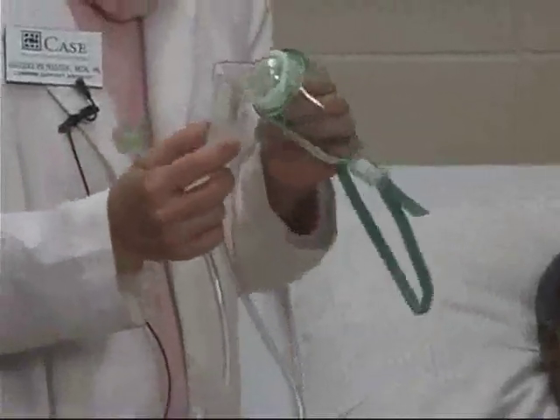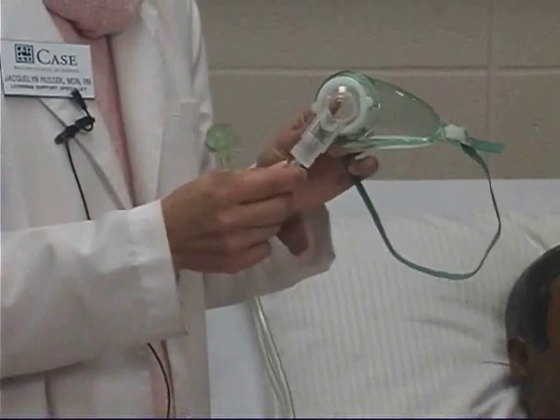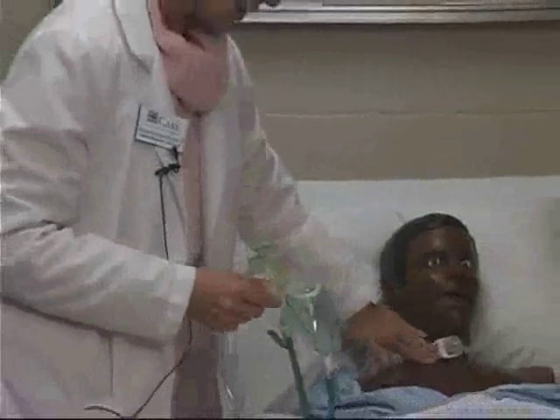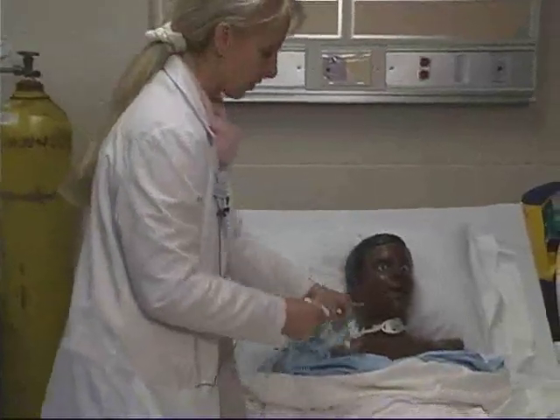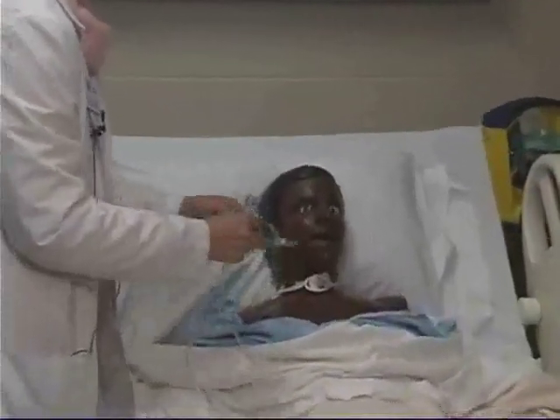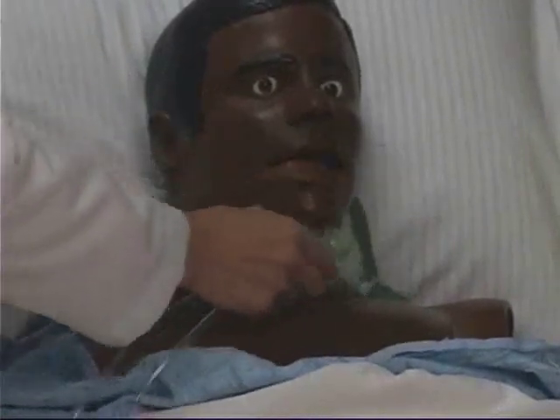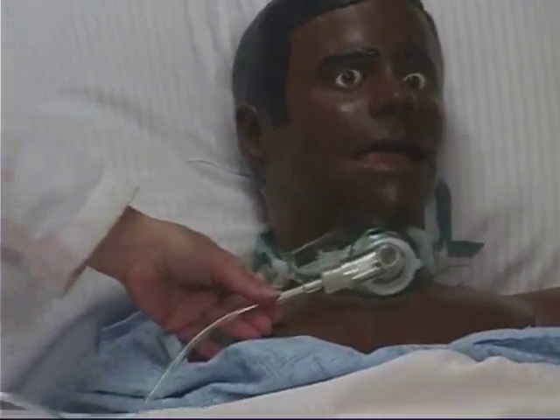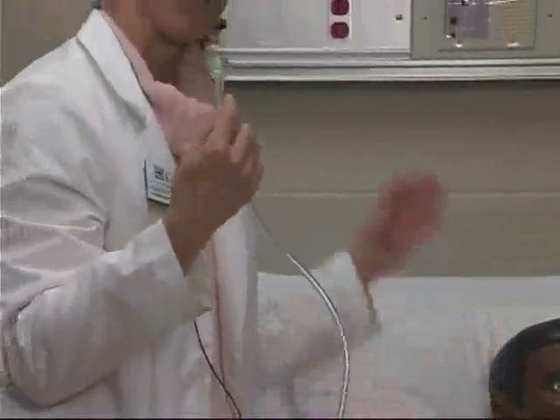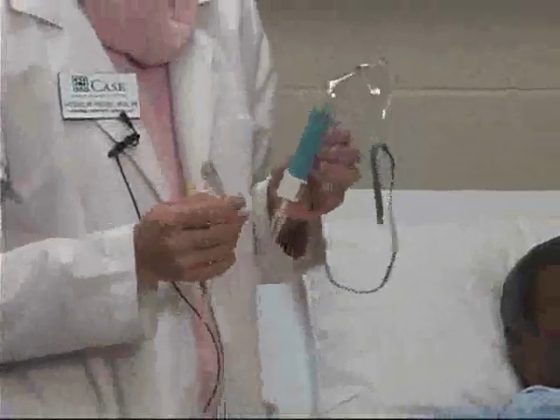I also wanted to show you an oxygen delivery device called a trach collar. You will see these on a medical floor, not just a critical care unit, because many patients have trachs. To deliver oxygen to a patient with a trach — which goes directly into the lungs — you'll see a mask like this placed around and directly over the trach. The end of this tubing is hooked up to the flow meter, and you set the flow meter according to the liters per minute ordered by the physician or advanced practice nurse.